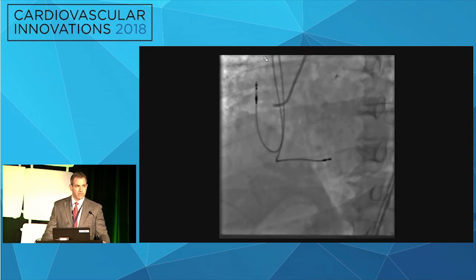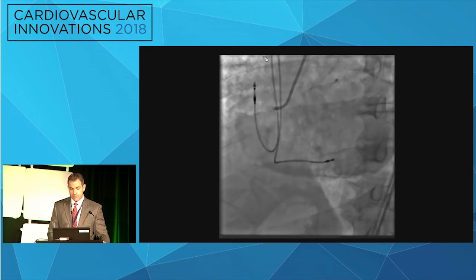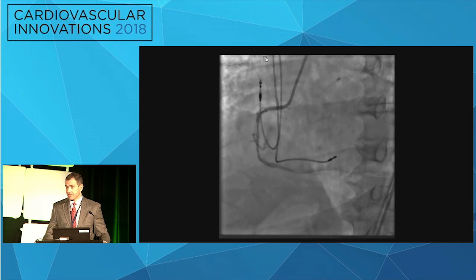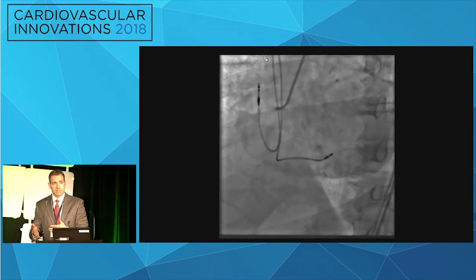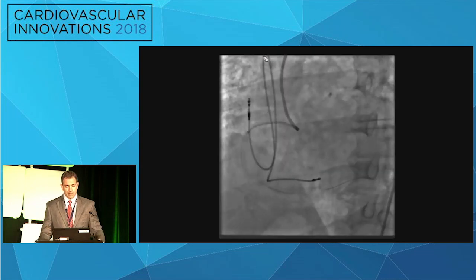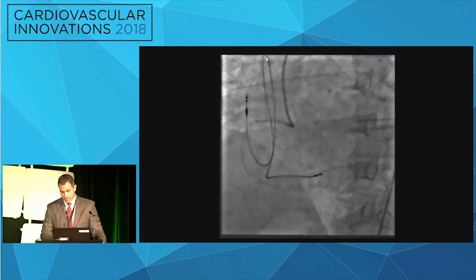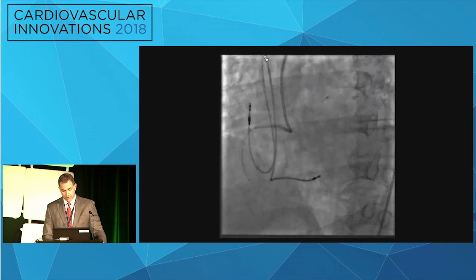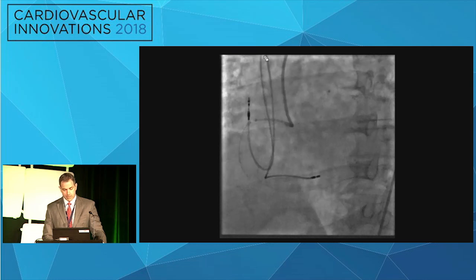I will say that we did have cardiothoracic surgery from the get-go in the room as backup when we attempted this. And when we did attempt this, we got very lucky, and the burr came out. And perhaps some of the ballooning we did helped facilitate that. It's hard to say, but it was a little bit of a forceful pull. Afterwards, we went ahead and ballooned distally and in the mid, used the guide liner for support, stented the distal vessel, stented the mid.